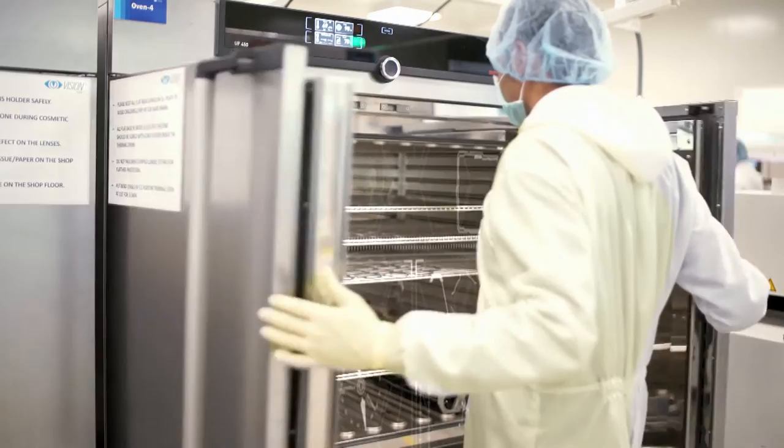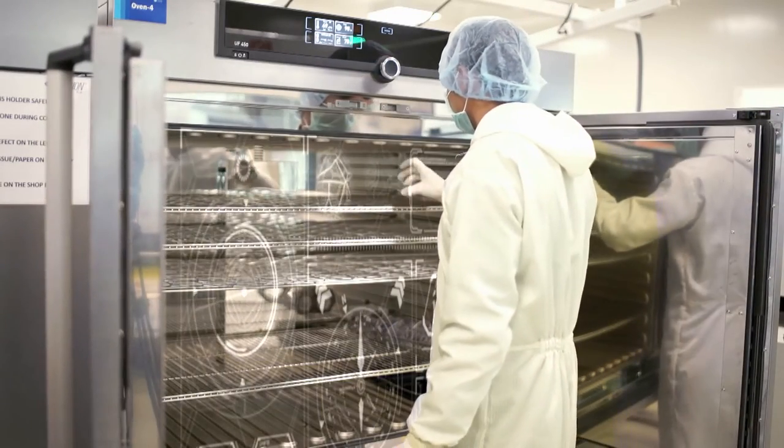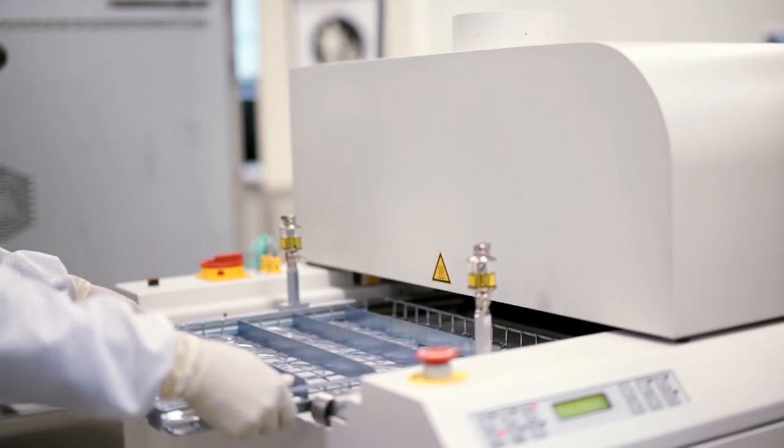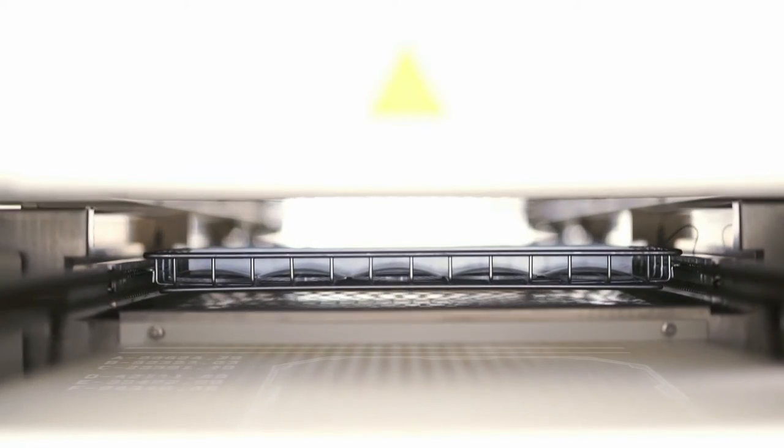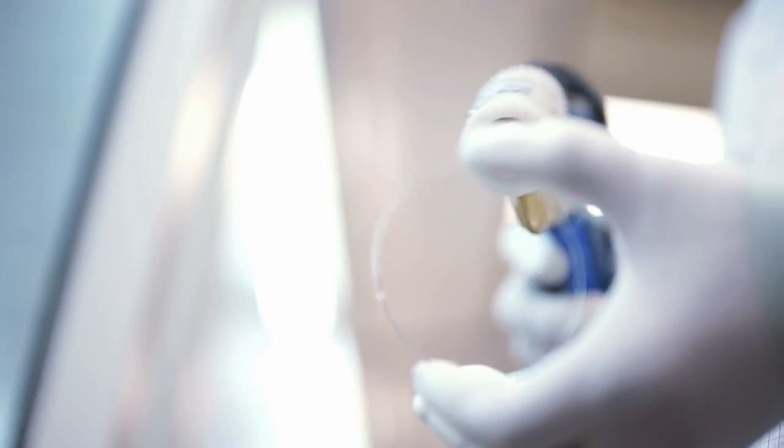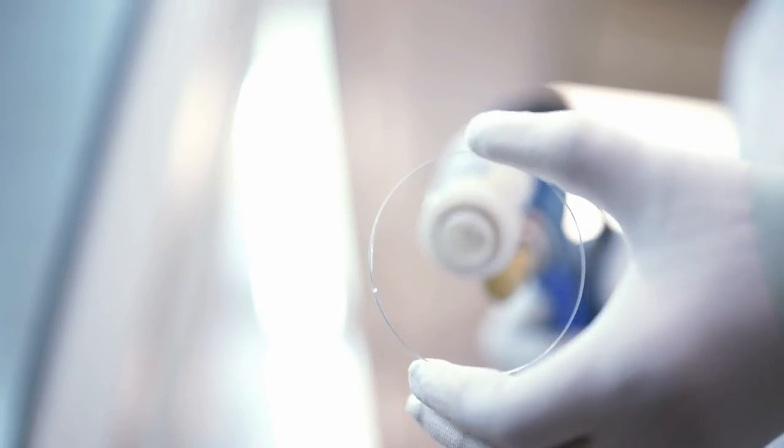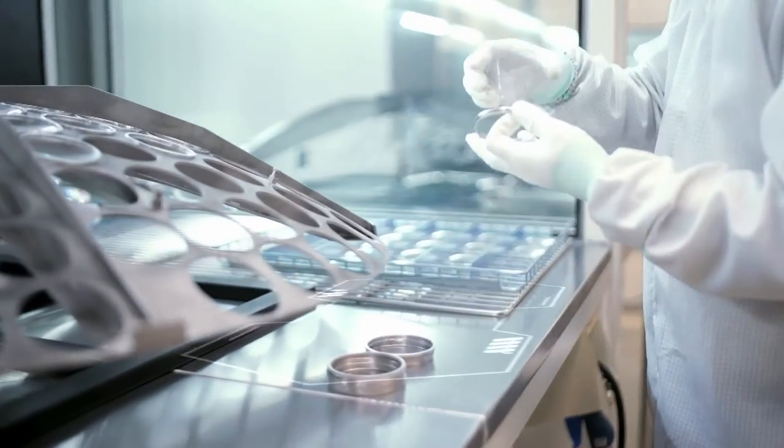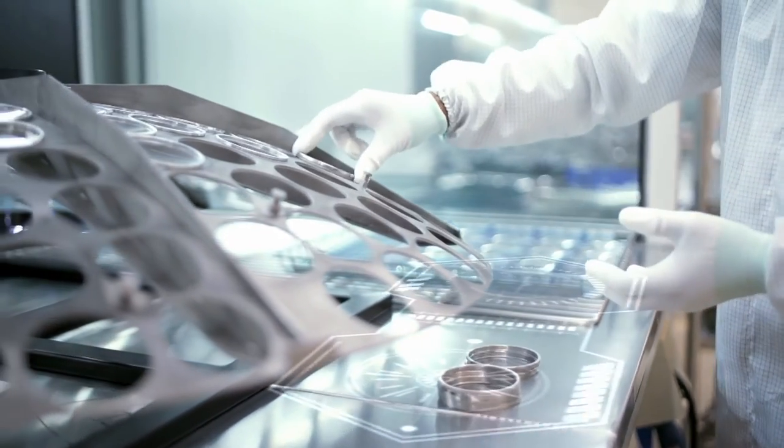And then cured in specific temperature and pressure conditions over a specified time frame. The lab uses lens index-matched varnishes which ensures good compatibility of varnish with lens substrate. After the hard coating process, the lenses undergo cleaning and quality check.